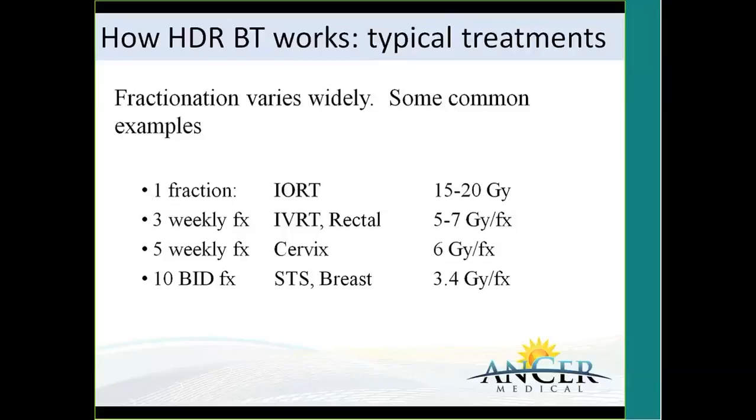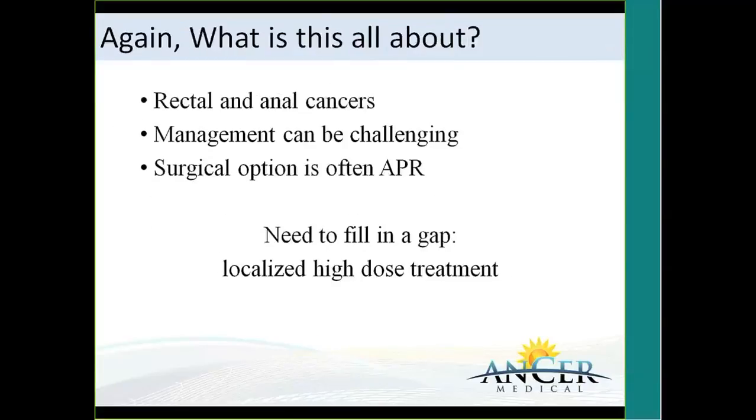That'll explain a lot for everybody. I went through all this so that when we talk about the plans, we can talk about why we have the AR applicator. It all comes together. Hopefully, it'll all make sense. So again, just to focus, we're talking about the AR applicator. We're looking for something that will be conformal, high dose, and will allow us to treat various targets.